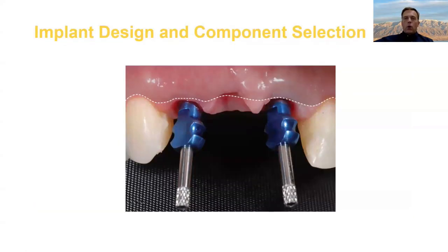So the first most important thing when you're restoring this implant, you have to know exactly what brand, line, and size has been placed. Understand the restorative workflows that are available, and make sure we have the correct components and instrumentation ahead of time. There are no generic components. An 050 driver is not a universal driver.